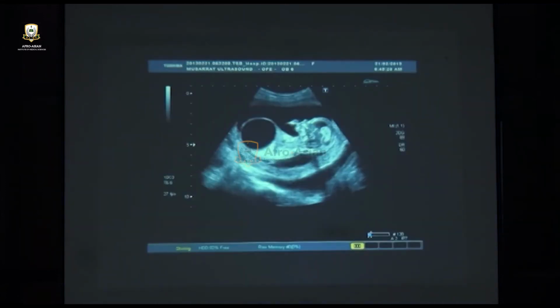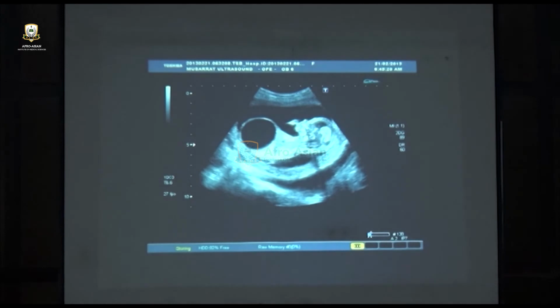Whatever the gestational age minus 5 is the abdominal circumference, and it works the other way around as well in order to know that. The body is smaller in the first half of the pregnancy, BPD is bigger, and it changes after mid-pregnancy.